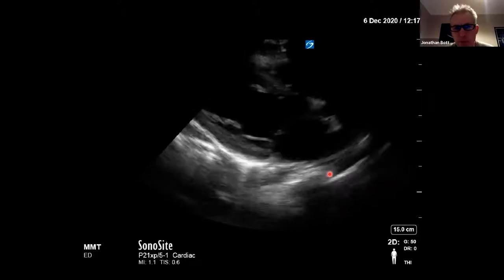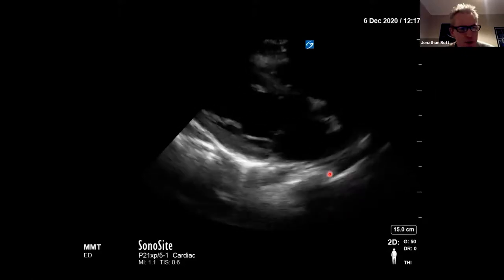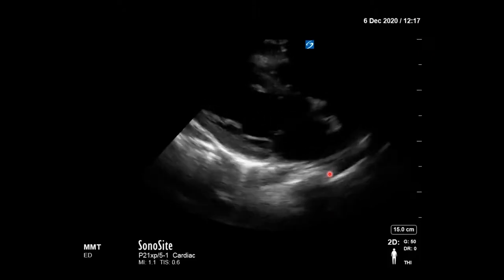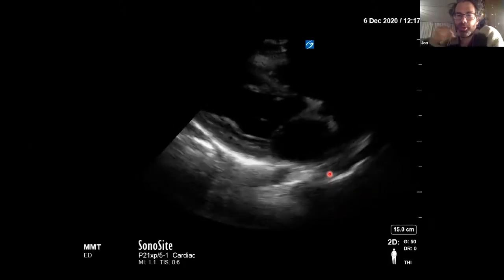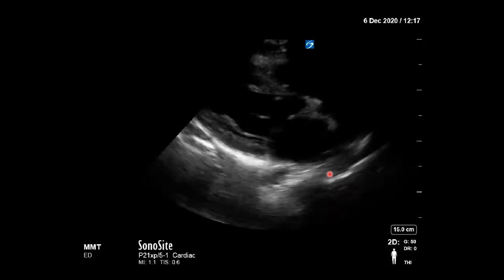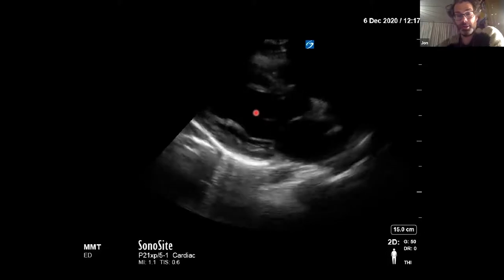I'm going to take a stab at abnormal, but I'm completely prepared to be wrong. It doesn't look like it's doing a huge amount. Are we assuming that the image is not just jittering along because of its quality, but that's the rhythm of the heart? It could be jerky because of the connection, possibly, but all right, okay. It was a normal rhythm. The LV function is impaired.